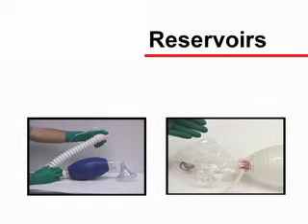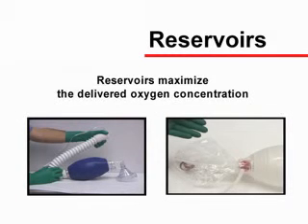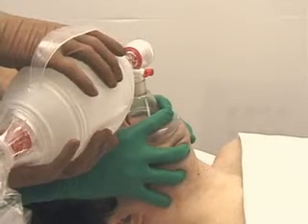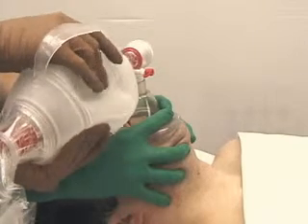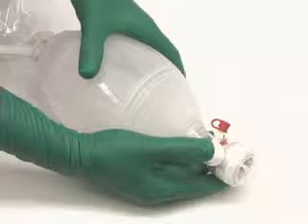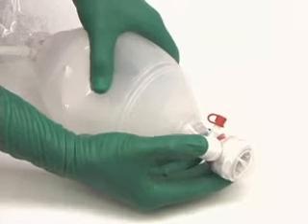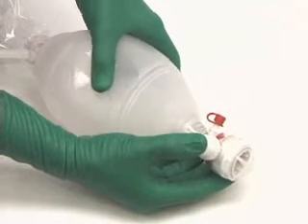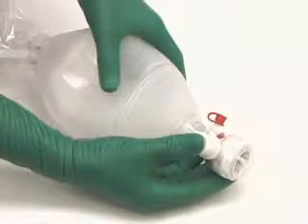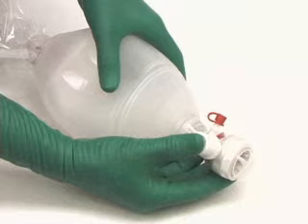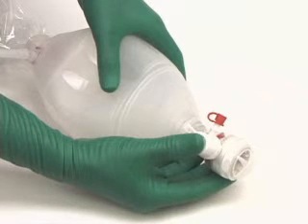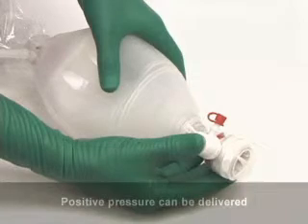Oxygen flow through bag valve devices with a tube reservoir can be confirmed by listening to the sound of gas flowing. The purpose of these reservoirs is to maximize the delivered oxygen concentration. A bag valve device's capability for delivering positive pressure ventilation should be tested before use. This can be achieved by sealing the connector with the thumb and squeezing the bag with reasonable force. If it is difficult to compress the bag or if air is forced between the connector and the thumb, positive pressure can be delivered.